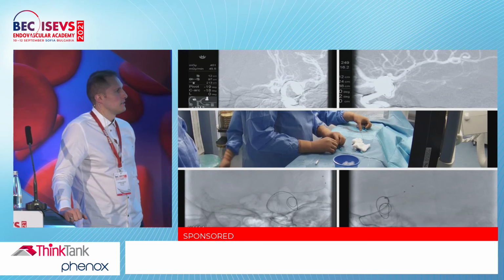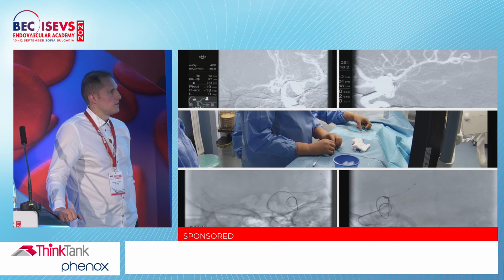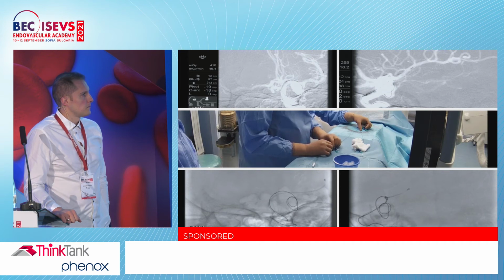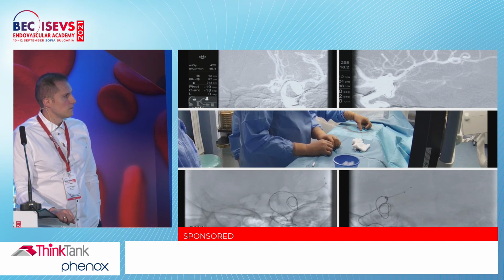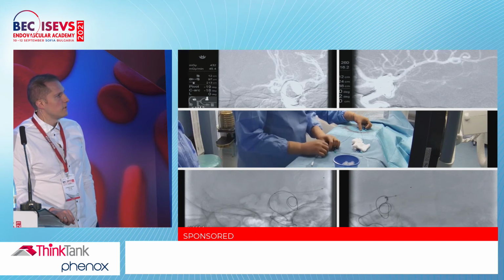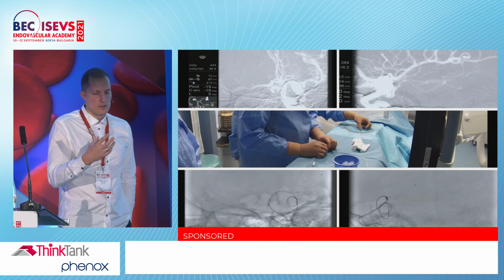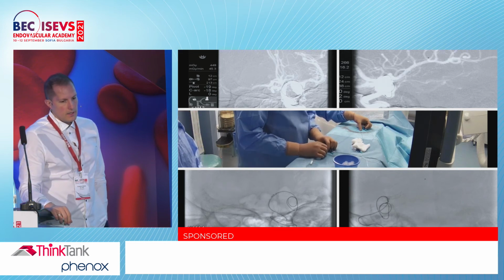So here we unsheath the stent. I will start to slowly retract the microcatheter while holding the stent in place. Can you see it correctly? Okay. So here is the wire of the stent. And now the stent itself is starting to come. You can see it's very nicely opened. So we just continue. This P64 stent has an additional wire around it, which is very nicely radiopaque, and you can see if it is well opened and in good position against the wall. On the lateral view, the right monitor, you can see how it stays inside the M2 segment.